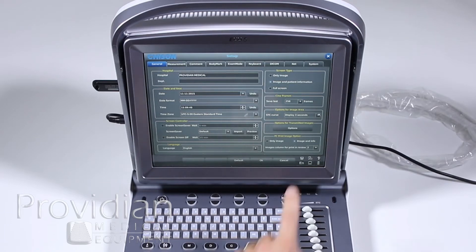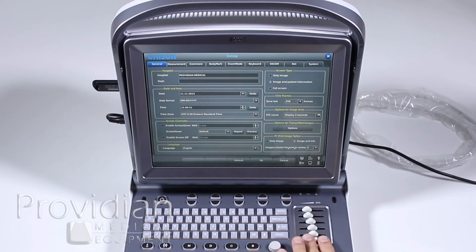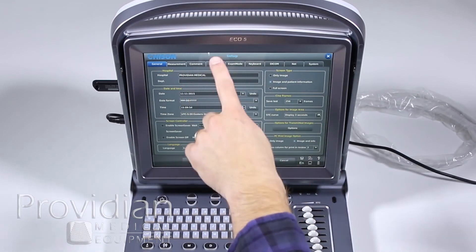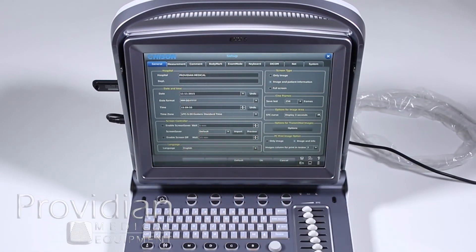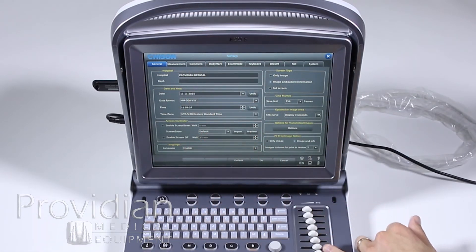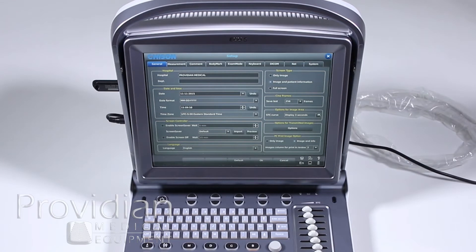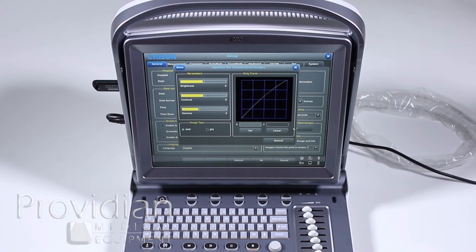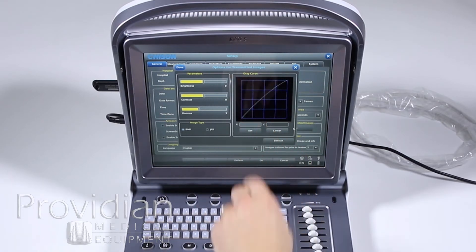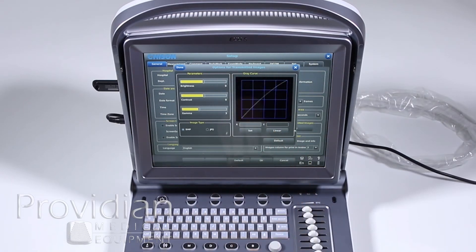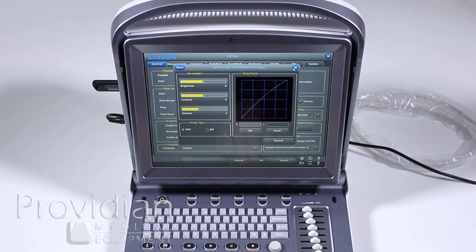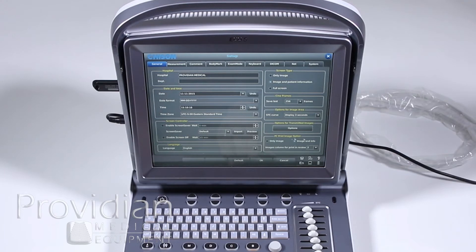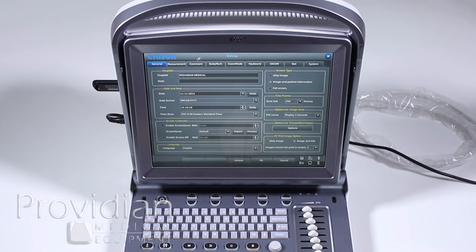This curve, this STC curve is this TGC curve. Every time we moved something, you saw this yellow line appear on the side of the screen that is showing the position of these TGCs. Options for transmitted images. This is if your images are transferring too dark or something of that sort, you can change these parameters here. I really don't recommend messing with them though. And when you print to a PC format, do you want to send just the image or do you want the information all over the screen?